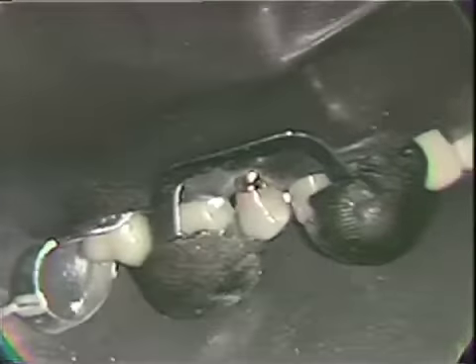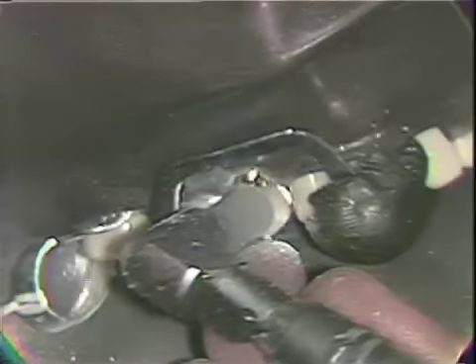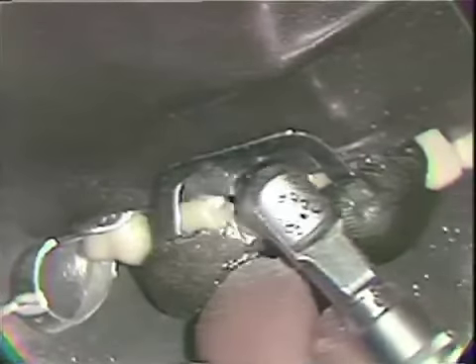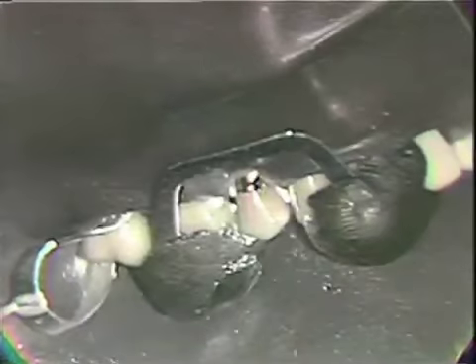Now we'll stop just for a moment, pick up some more tin oxide and approach this on the distal area. And that is sufficient. Now we'll go ahead and cleanse this with water and with air in the evacuator.